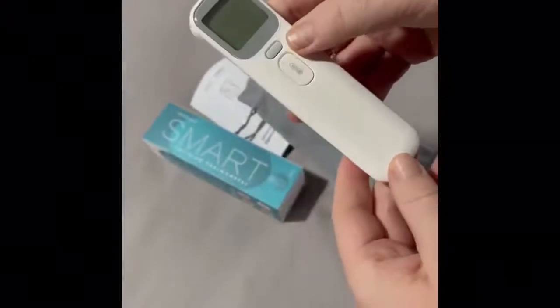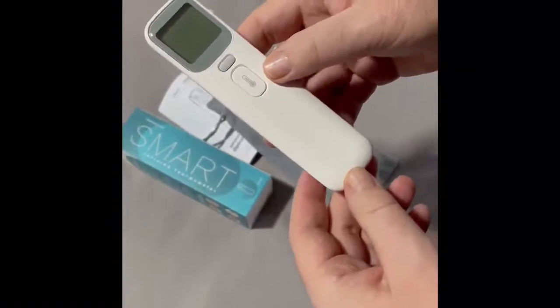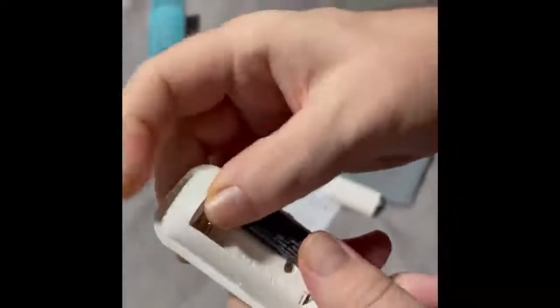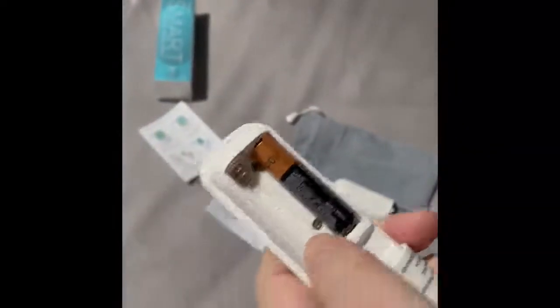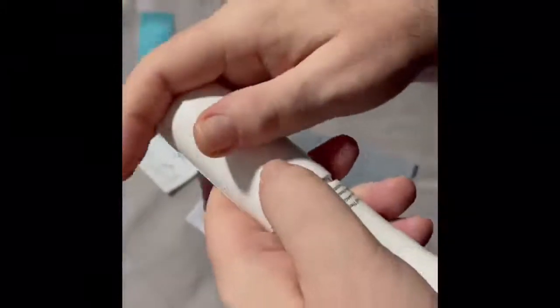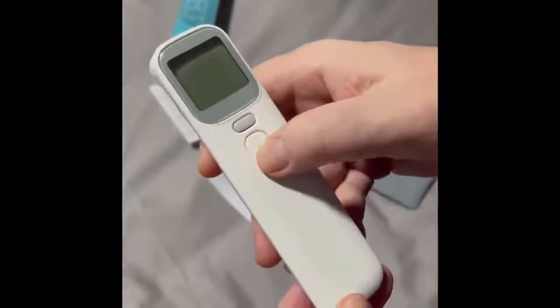Just say, yeah, I'll put the batteries in, and then I'll give it a test and see how it works. Well, I've got a couple of AAA batteries, and we'll put them in the machine now and give it a test. That audio indication there was from the actual thermometer. Right, so let's give it a test. Now the battery's in, let's push the power on button.